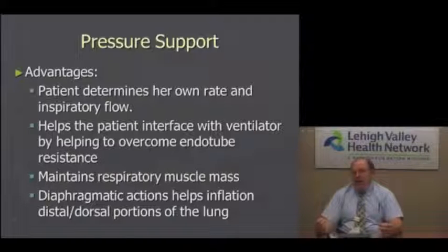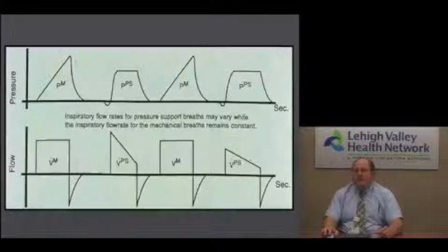Okay, which again I alluded to earlier, that's where areas of lung collapse, atelectatic areas, and a lot of times fluid accumulation occur. So spontaneous breathing and pressure support helps minimize atelectasis and retained secretions in those distal portions. Even high PEEP, even high volumes cannot be as effective, especially in the left lower lobe, as spontaneous breathing. So this is why we encourage this quite frequently and quite early in the ventilatory sequence.